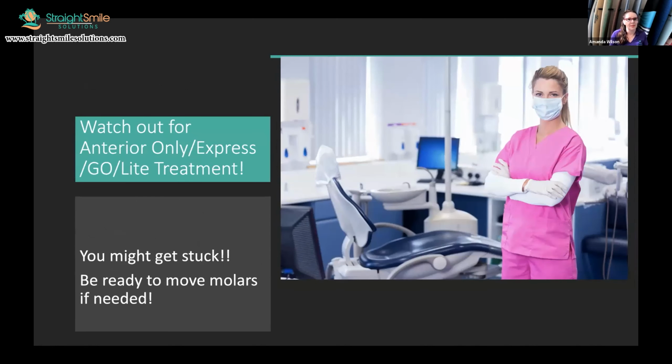All right. And then we already talked about staying away from your Express, Go, Lights, anterior only treatments, SCOs. I wouldn't recommend that.